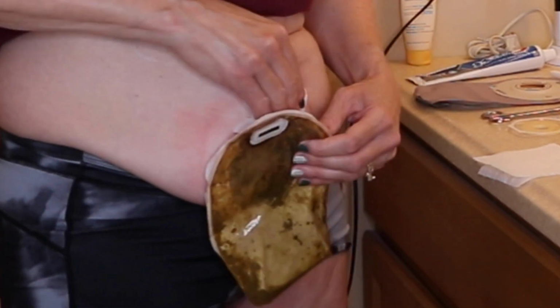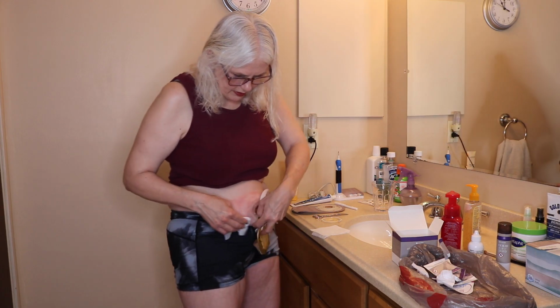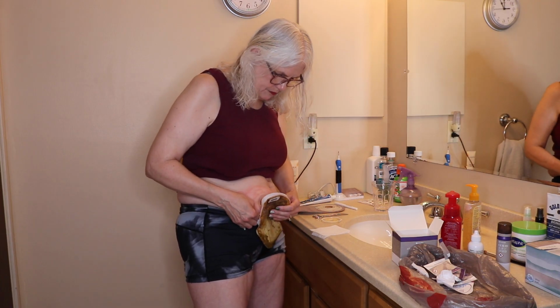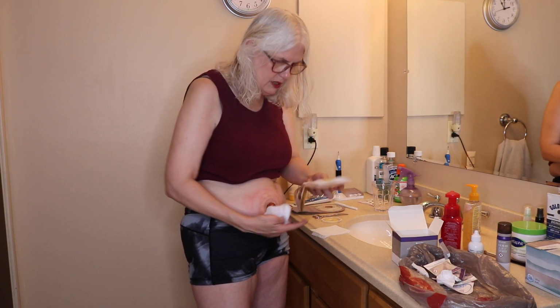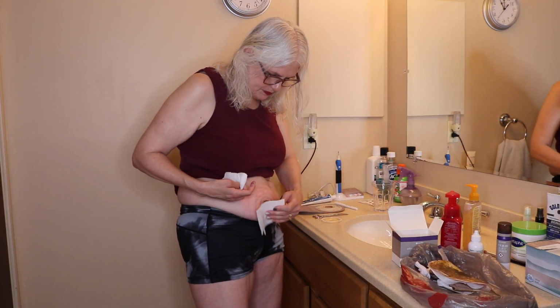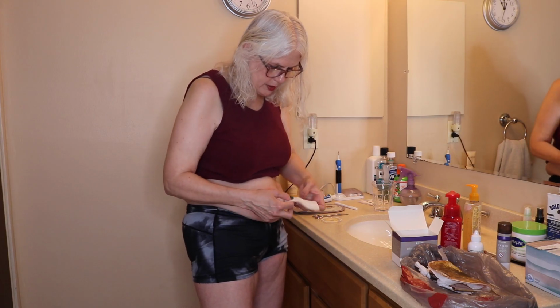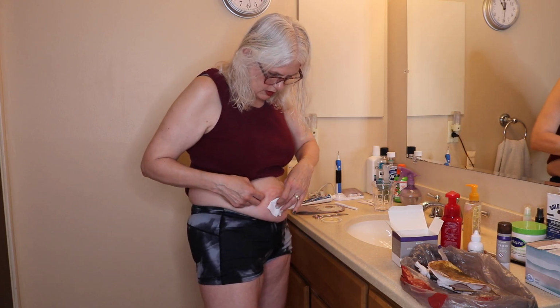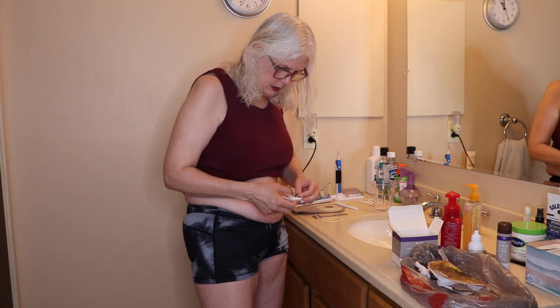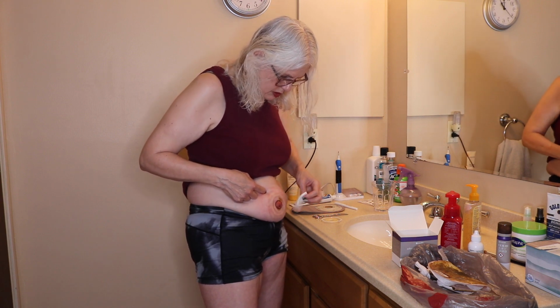And I have had one shower in between. I didn't know if it was going to last through that either, but I also made sure that when I was trying these bags, I was going to be home, that I wasn't going to be out and about anywhere. I think I did run a few places this week, but yeah, just to make sure that in case I had a leak, I would be home and I'd be able to change it. And then I would know and I would get rid of that box. But it's kind of like, all right, it's been working, so even though I have a lot of other bags, I figure I'll just still go through these.